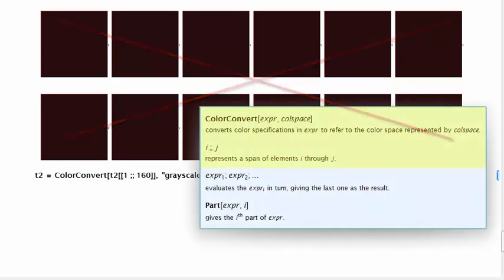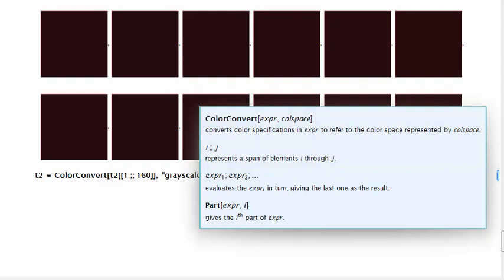We can select the non-null elements of t2 by reassigning the variable to the first 160 slices. In Mathematica images are stored by default in RGB. We can take this opportunity to change the representation of the t2 data to grayscale which saves memory.